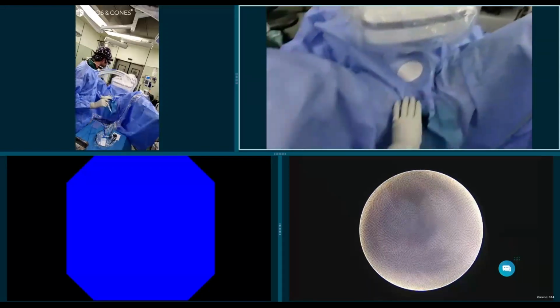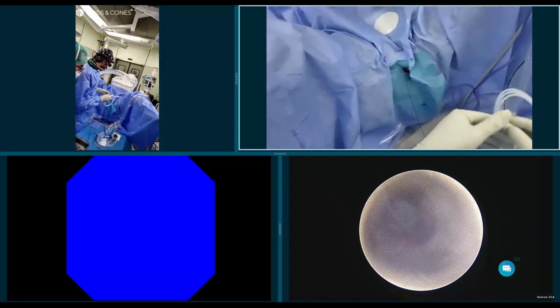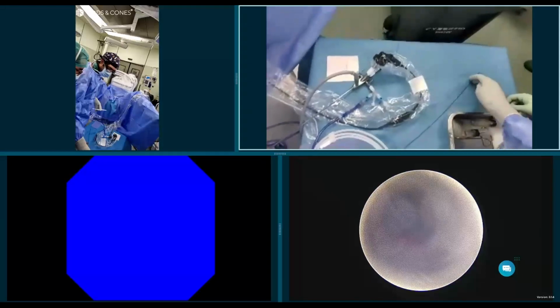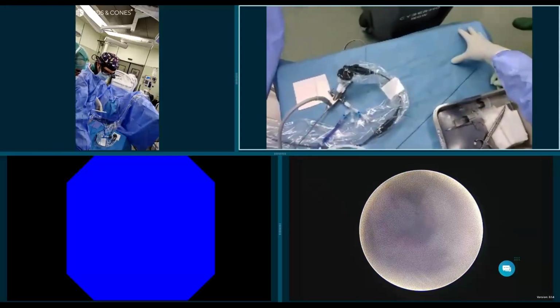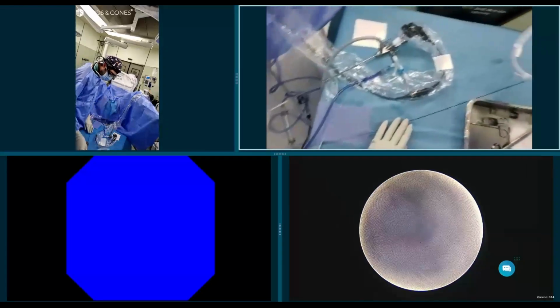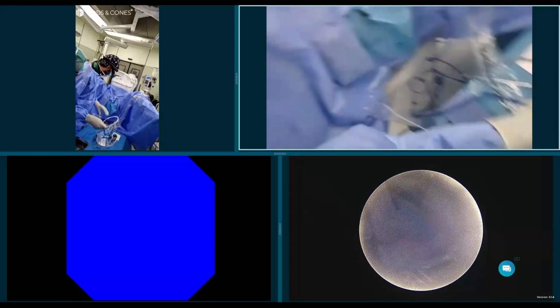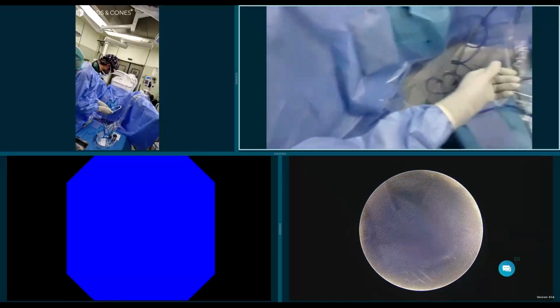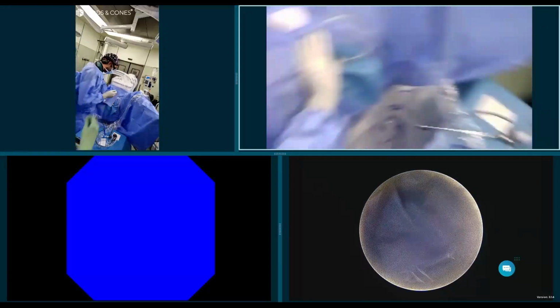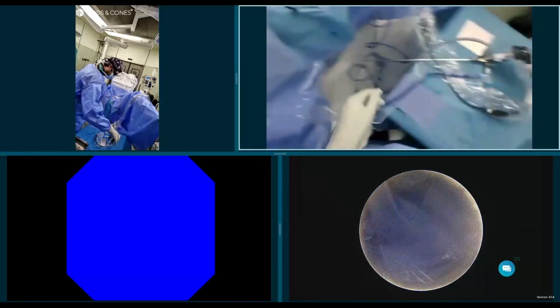So I know that my guide wire, as I felt, and by tactile feedback, should be in the kidney, and also because the tip of my guide wire is at the tip of my table, so most probably it will be in the kidney. What I do is that I put this safety guide wire on the coil again, and I just tape it on the left side of the patient, always on the left side of the patient. So I tape it like this. Okay, that's good.